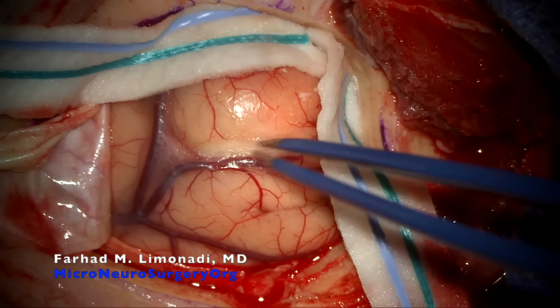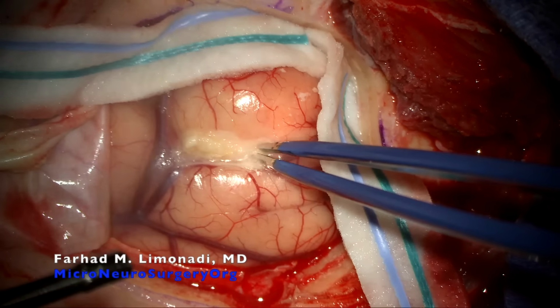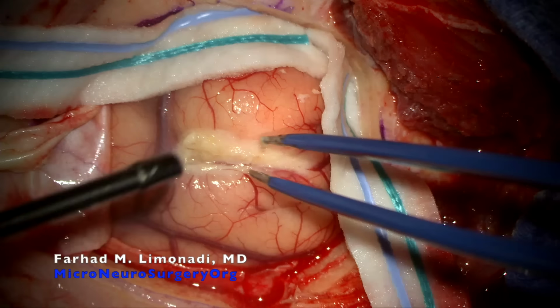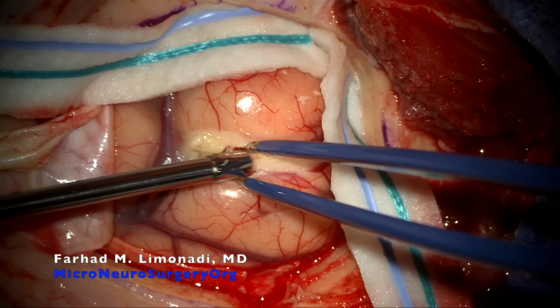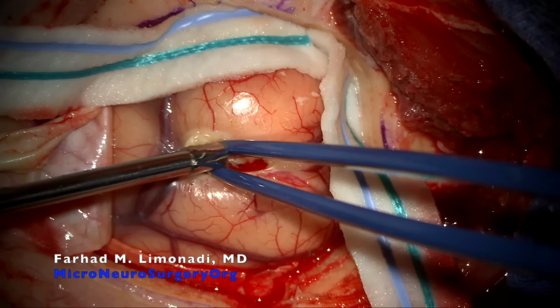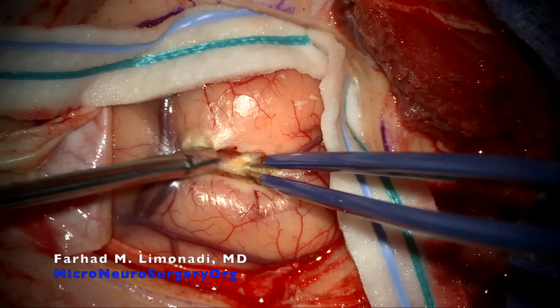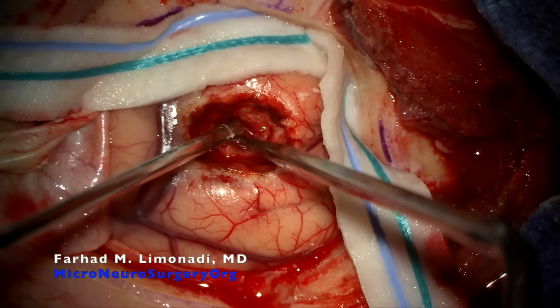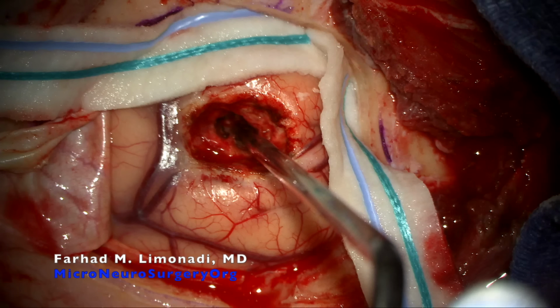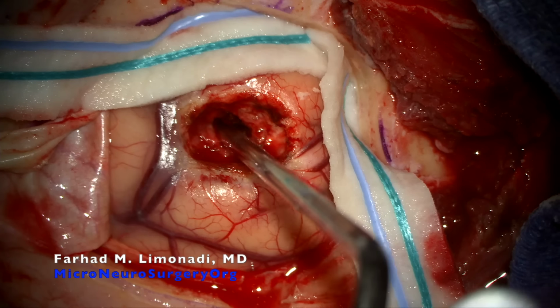Bipolar cautery is used to create a small corticectomy through which the superficial edge of the tumor will be exposed. The general plan is to remove a relatively large tumor through a small corridor and therefore minimize damage to the brain. Through this small corticectomy, which is approximately half the size of the tumor, the superficial pole of the tumor is exposed, and then using bipolar cautery, a small hole is created through which the tumor is going to be debulked.